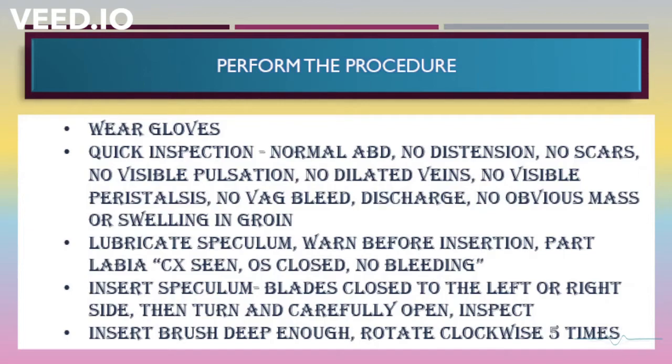And then with your left hand or your non-dominant hand, part the labia, and with the right hand, you would need to insert the speculum. So when you're parting the labia, you need to see whether the cervix is seen, whether the os is closed, and there is no bleeding.